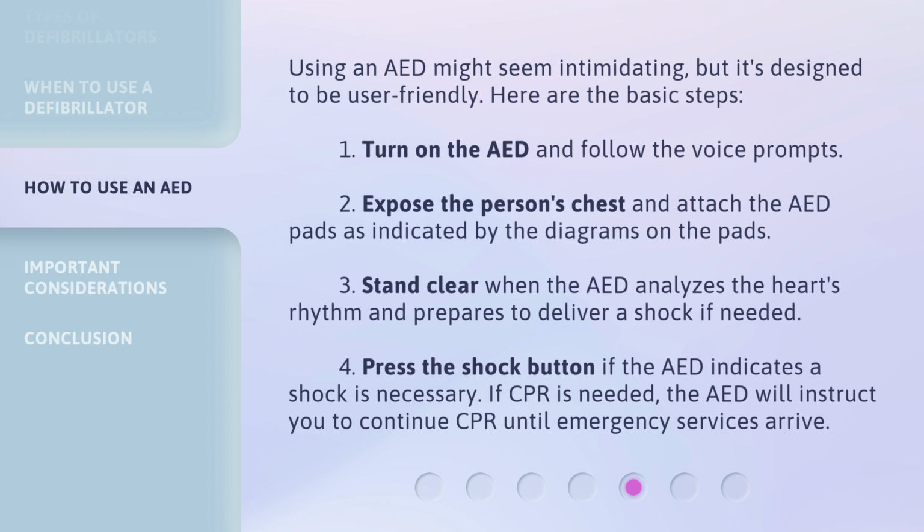3. Stand clear when the AED analyzes the heart's rhythm and prepares to deliver a shock if needed. 4. Press the shock button if the AED indicates a shock is necessary. If CPR is needed, the AED will instruct you to continue CPR until emergency services arrive.